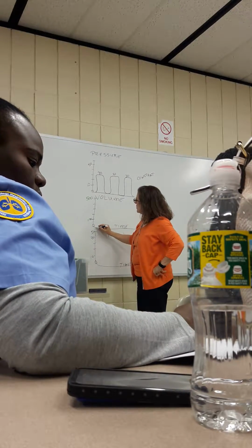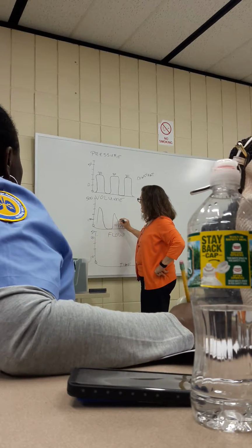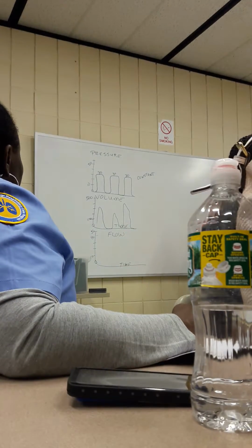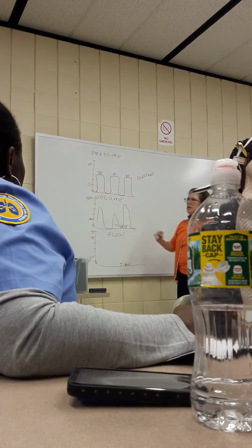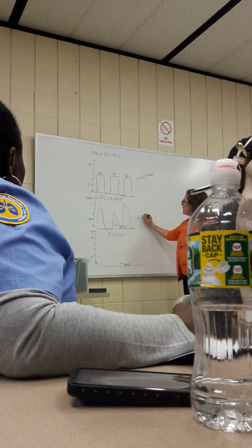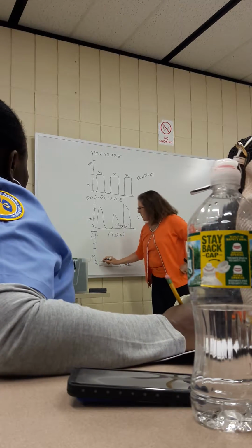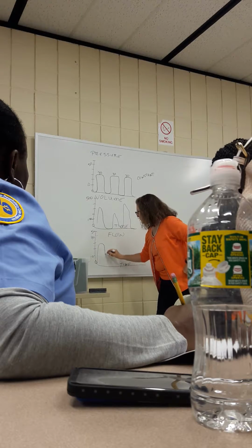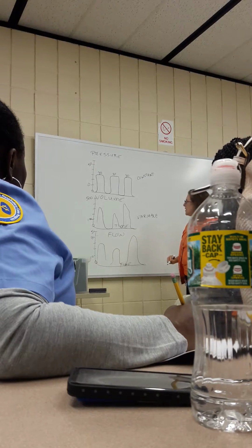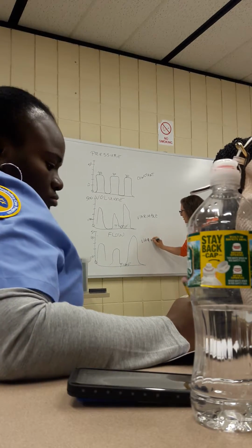And here's my volume. Is my volume constant or is it variable? Variable. Okay, so this is variable. And then here's my flow. Is that variable? Variable. Again, my pictures are not good.